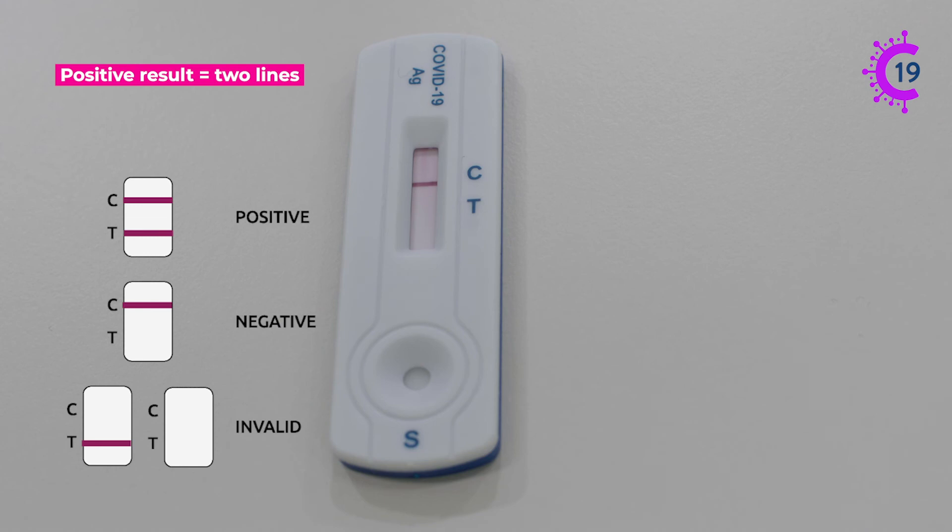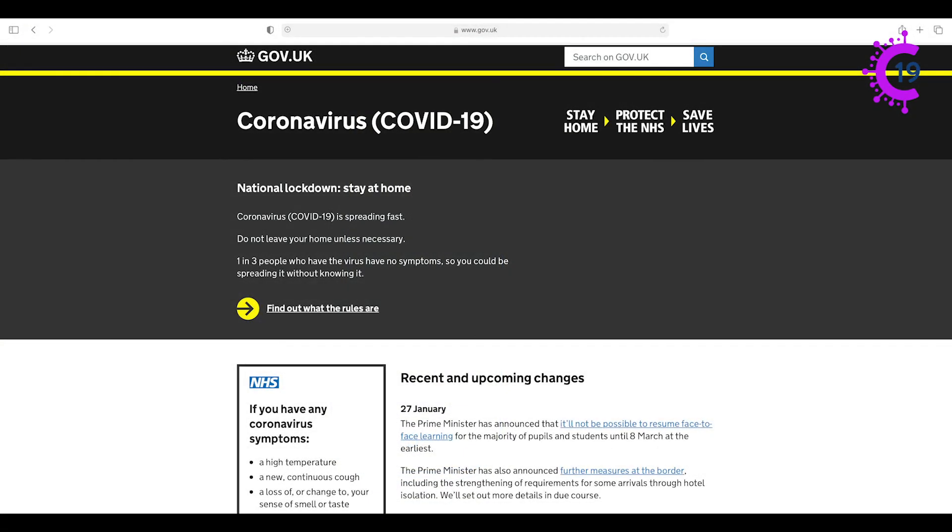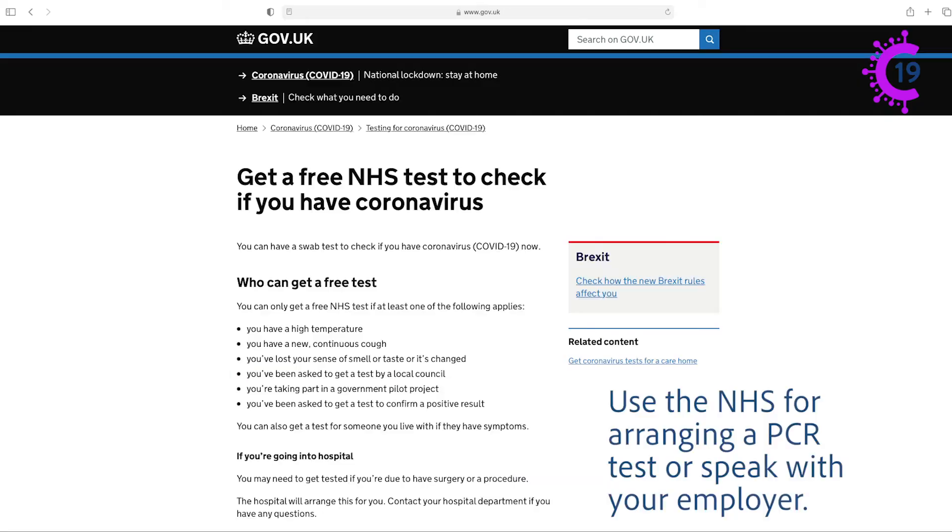If there was no line visible at the T this means the test result is negative and it's likely you did not have coronavirus at the time that this sample was taken. However, you should still continue to follow government guidance regarding social distancing and hand hygiene and arrange a PCR test if you develop any symptoms of coronavirus.